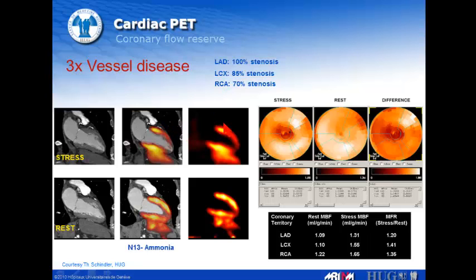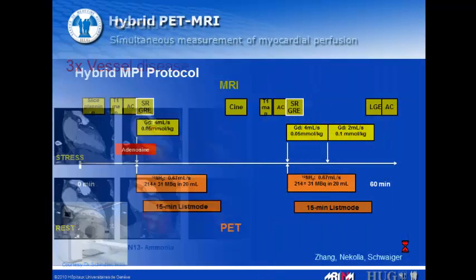Well, this one in the anterior, okay, we can see it, but the other ones, especially when it's a balanced ischemia, it's very difficult to quantify with SPECT. And with coronary flow reserve, fully quantitative by PET, here a clearly decreased flow reserve is showing this patient has real ischemia, and there has to be something done for him.